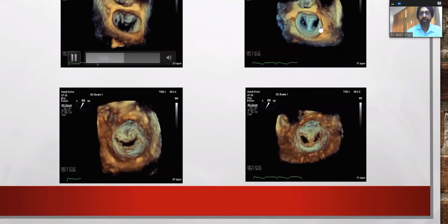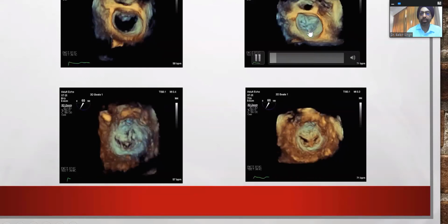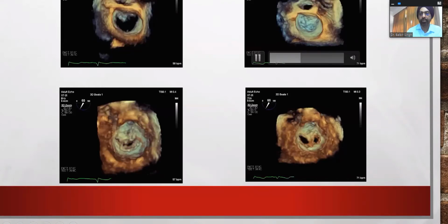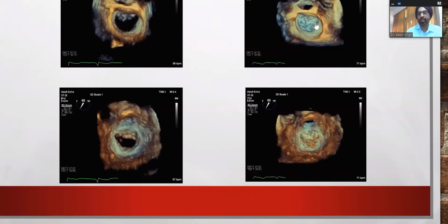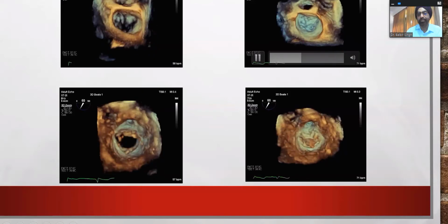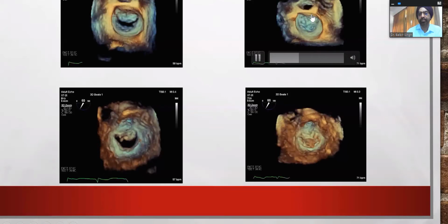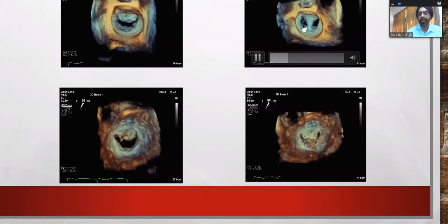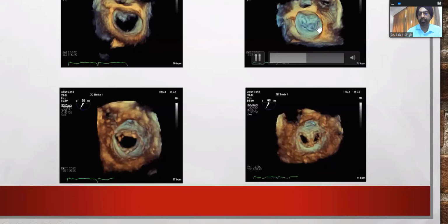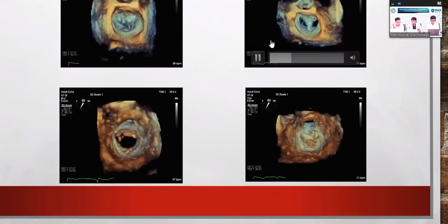Now, when you place the clip, you have to place it like this, straight vertical, dividing the mitral valve into two. And you place this in the LA and then push the clip into the LV so that you retain that position. And you are not trying to manipulate too much in the LV because you have chordae and papillary muscle to play with. Now you see this clip is very nicely positioned, perpendicular to this mitral valve, cutting it into two orifices. So the two orifices are there. You see the double orifice mitral valve. This is what you want to achieve.